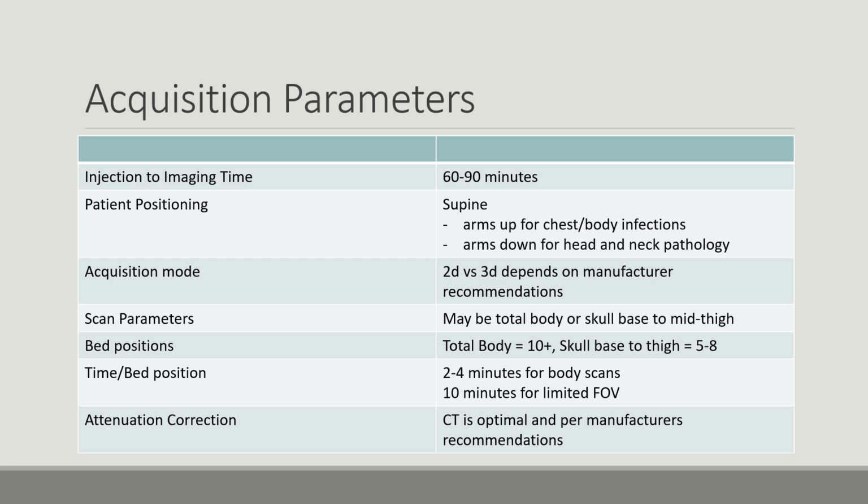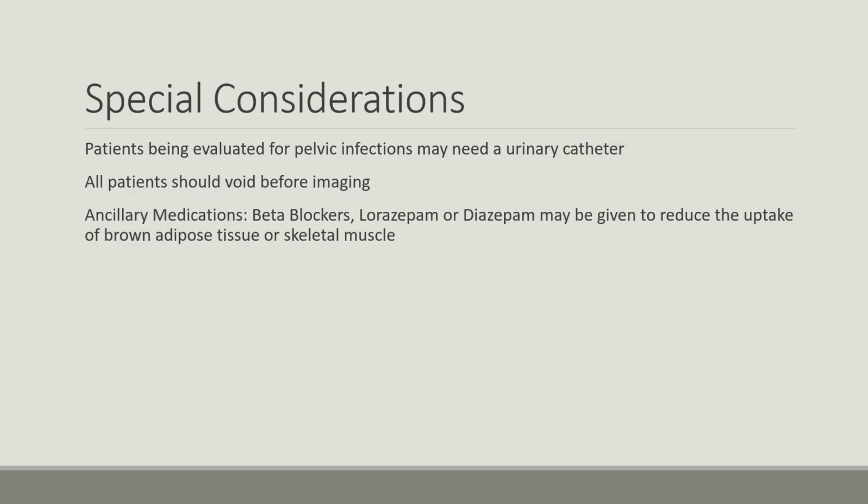Attenuation correction, CT is optimal and per the manufacturer's recommendations. CT is great, especially if you're using attenuation correction and iterative reconstruction. CT provides a better quality image. So there are some special considerations.